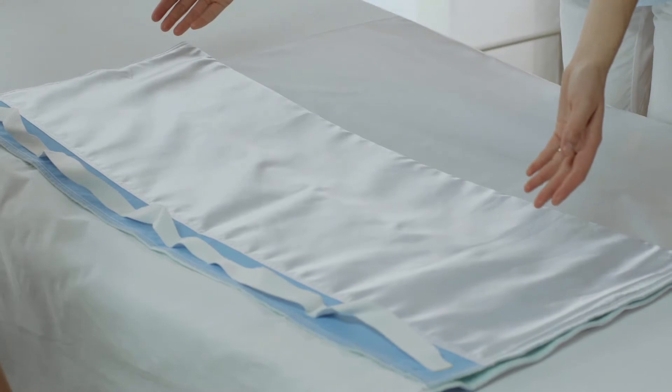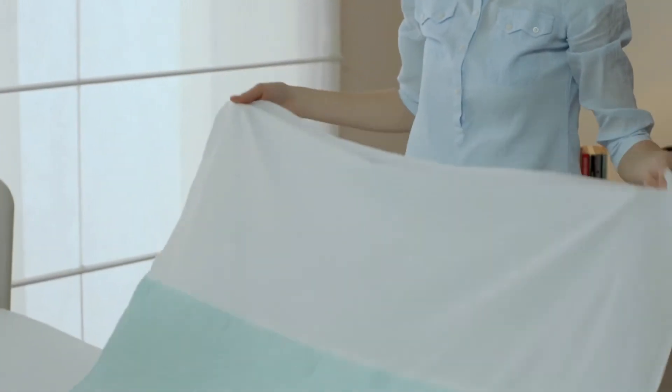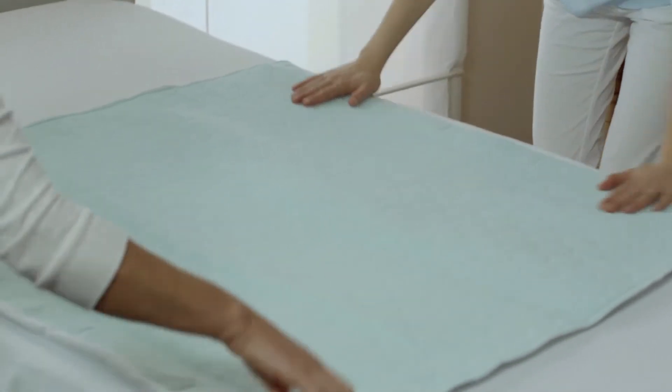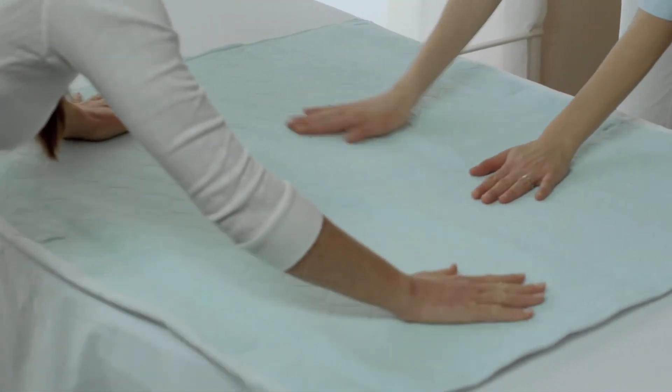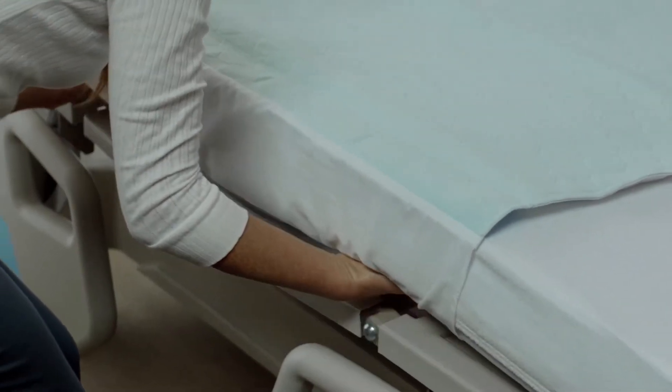For ensuring maximum efficiency and ease in handling and positioning patients, CaressSlide should be used at the bottom and AbsoSlide should be used on the top, in a way that the satin surfaces of both overlap. You can fix AbsoSlide on the bed by placing the tuckings underneath the mattress to prevent uncontrolled sliding.